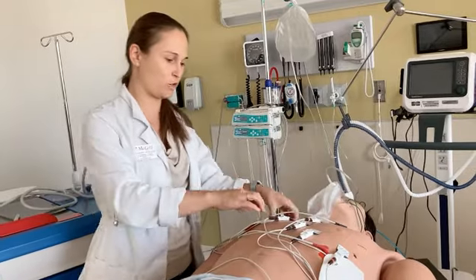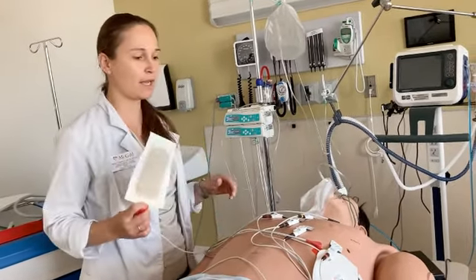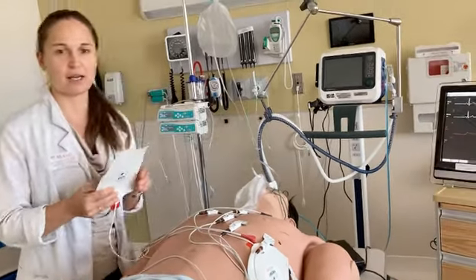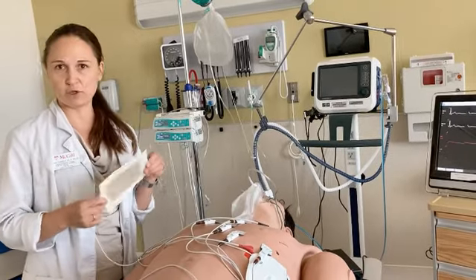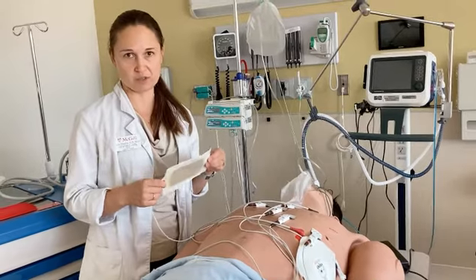So I'm going to remove this pad, and I would get help to turn my patient and place this pad on the mid-scapular line somewhere in the area of the third intercostal space.